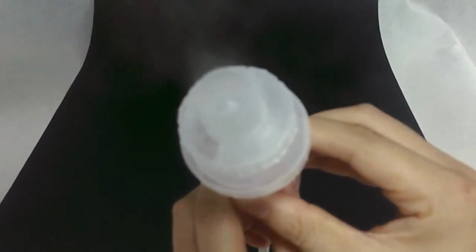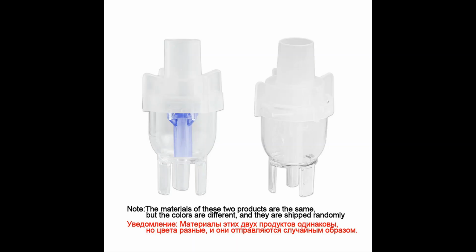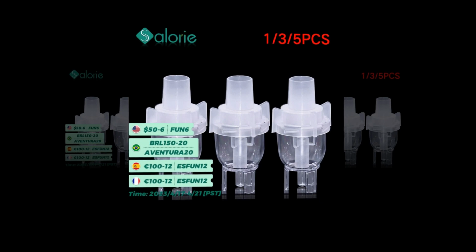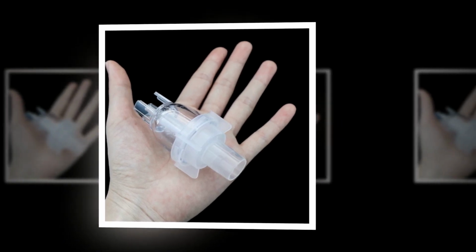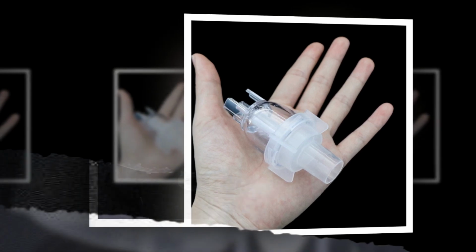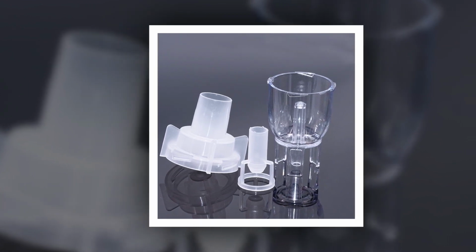Nebulizers might be used in conjunction with or instead of inhalers. An inhaler is a small, handheld device that delivers medication through a spray mist you breathe in. Nebulizers may be easier to use than inhalers, especially for young children. An inhaler requires learning a specific breathing technique, while a nebulizer only requires breathing normally. However, they take longer than inhalers, which might be challenging for very young children. Nebulizers can also be helpful for people who have a difficult time using inhalers due to arthritis.